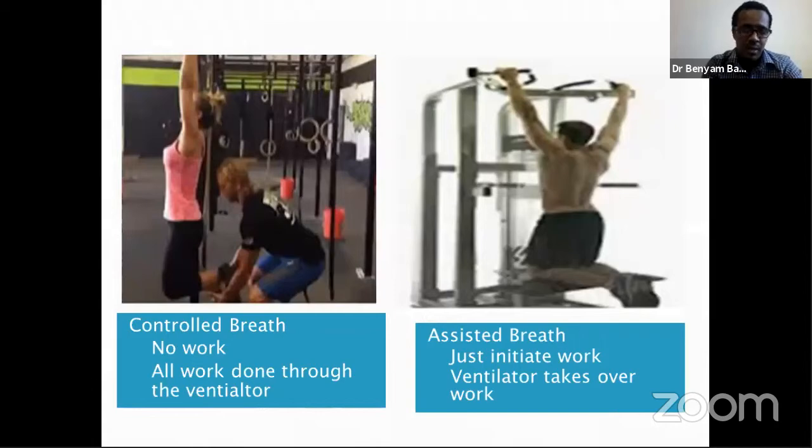So this is an analogy of what we discussed so far. The first image shows a control breath. Let's say you have a gym buddy. So basically you're doing the pull up, but your gym buddy is technically pulling you up and down. So technically you're not doing any work. So that's more or less a control breath.